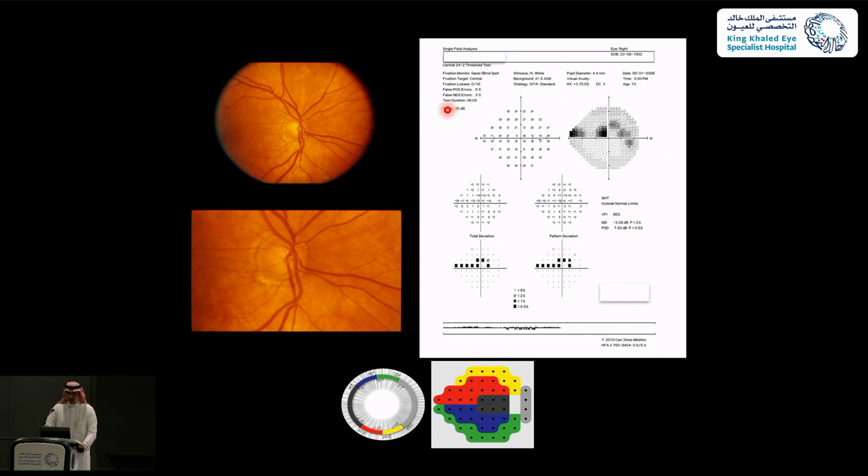You will always need to pay attention to whether the fovea is on or off. If the fovea is on and gives you a sensitivity of 35 or 30, and at the periphery of the retina the patient has a higher threshold sensitivity of, let's say, 40, it doesn't make sense. And vice versa: if the patient has low threshold sensitivity at the foveal area and better sensitivity in the adjacent areas, the patient might have retinal diseases that cause these changes.